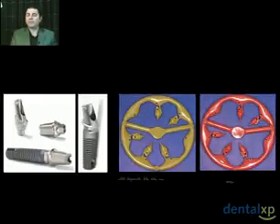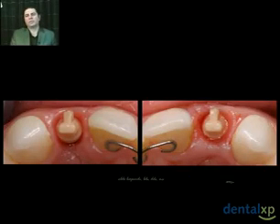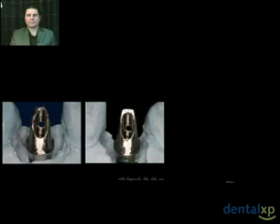Most implant companies provide the clinician trial abutments, and the trial abutments are actually very important. If you look at the slide to the left, there are plastic trial components that have different marginal heights and different angulation. By utilizing these trial components, we can select and purchase the appropriate component from the manufacturer. For example, the trial components that you see in front of you are angled abutments that have a 2mm cuff. Consequently, I'm going to order 2mm cuff angled titanium contoured abutments.